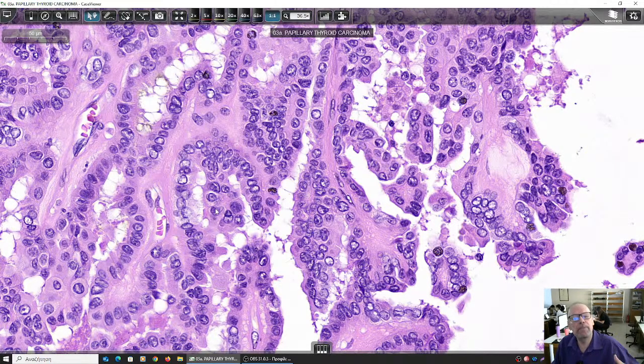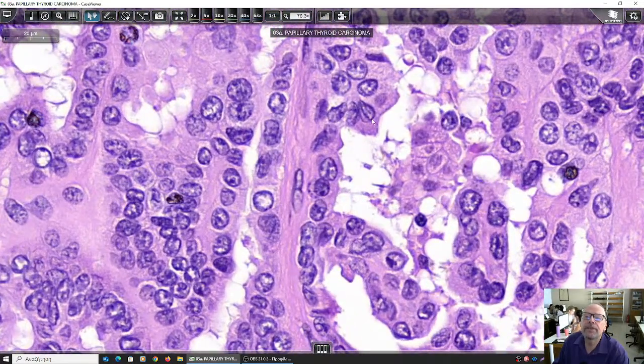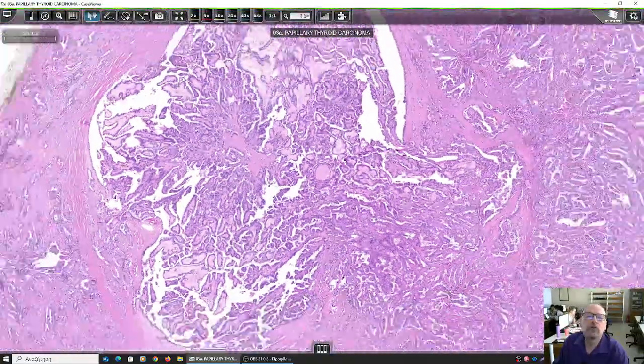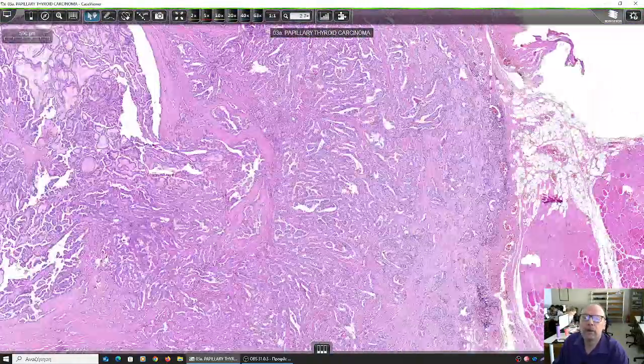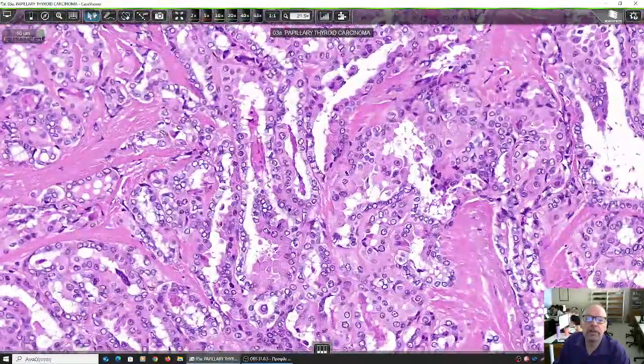Of course, they may be increased in size by comparison to the ones that we have previously seen in the adjacent normal parenchyma, and they also have some grooving. Here it is. You see the grooving? This one, and that one. And we should also look for pseudonuclear inclusions. That means something like small balls within the nuclei.